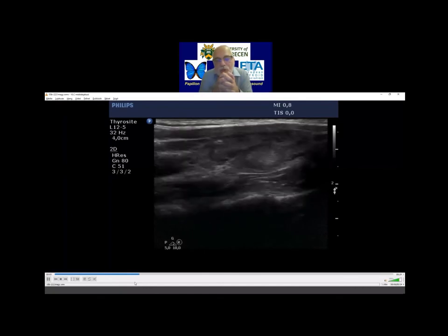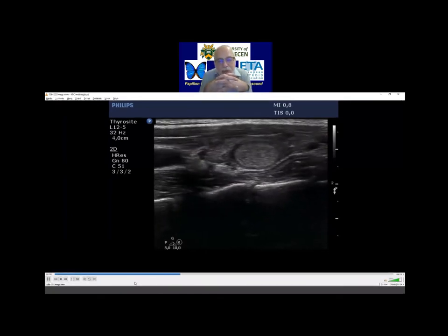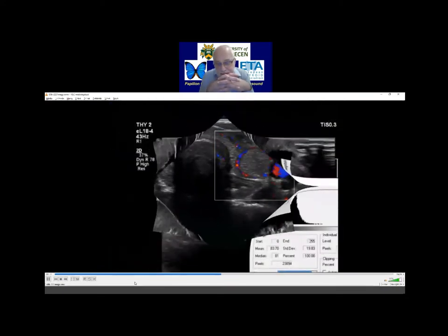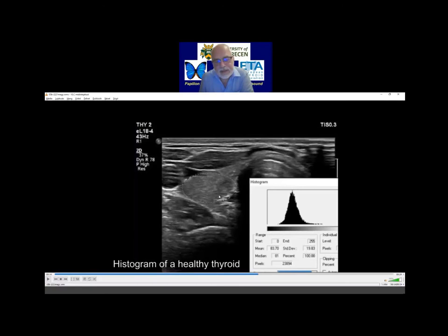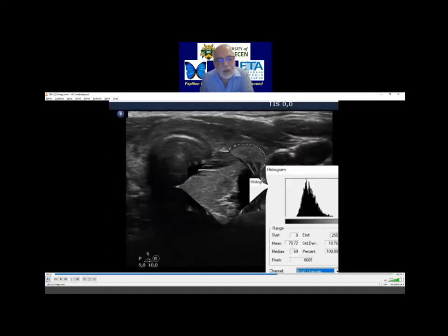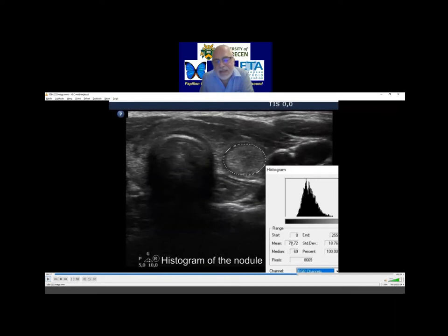This nodule occurred in a hypoechoic thyroid, and this is a seemingly isoechoic nodule. But please remember, this is a healthy thyroid — this is not from this case, this is another patient. The healthy thyroid had above 80 pixel mean pixel of echogenicity — 80. This one is at 70. So if we compare this nodule to a healthy thyroid, this nodule should be regarded as minimally to moderately hypoechoic.